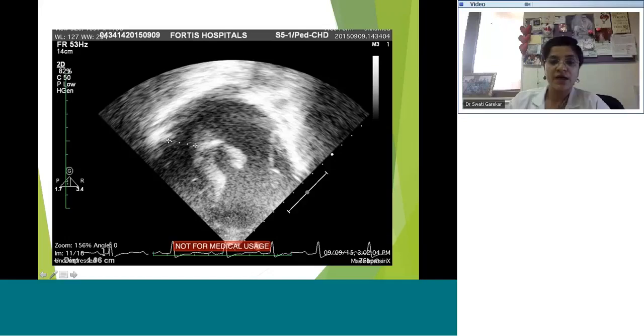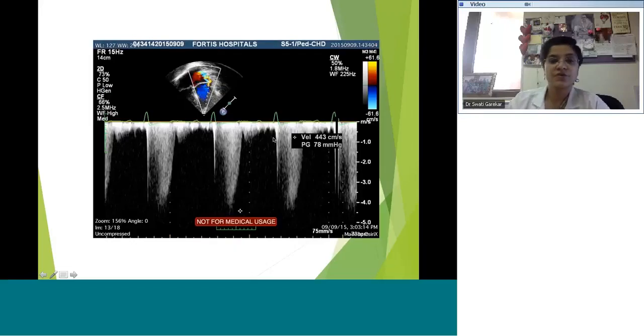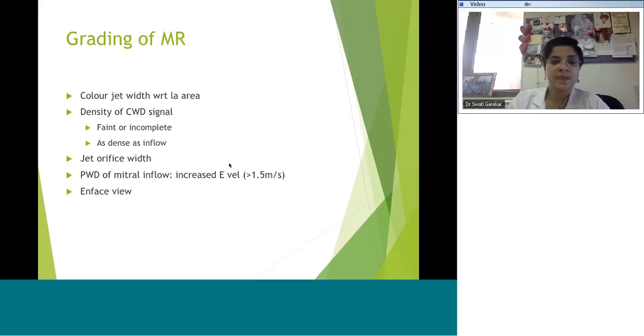Here you see the mitral valve. Annulus was much larger than tricuspid, but it's not enough just for that information. You need a Z-score. You need to say, okay, so this is +3 and hence worthy of annular tightening. You can also look at a CW spectral Doppler interrogation of the MR jet, and you can see how dense it is. If it's not very dense, that goes in favor of mild or moderate regurgitation.